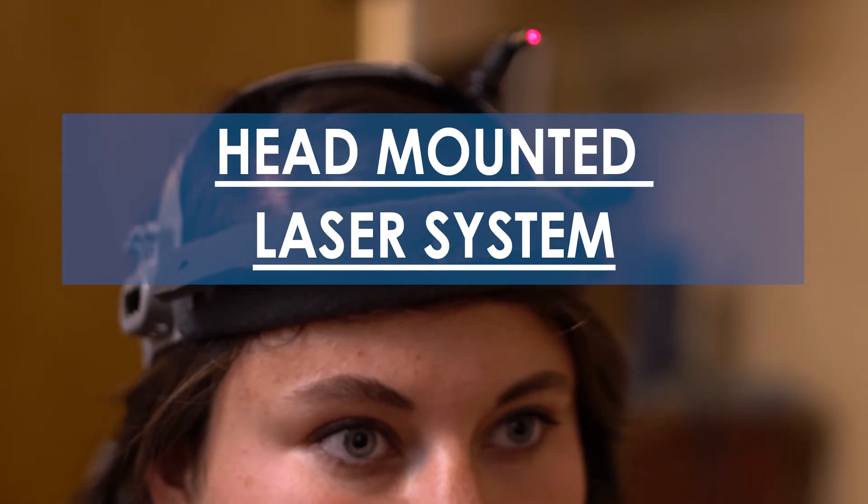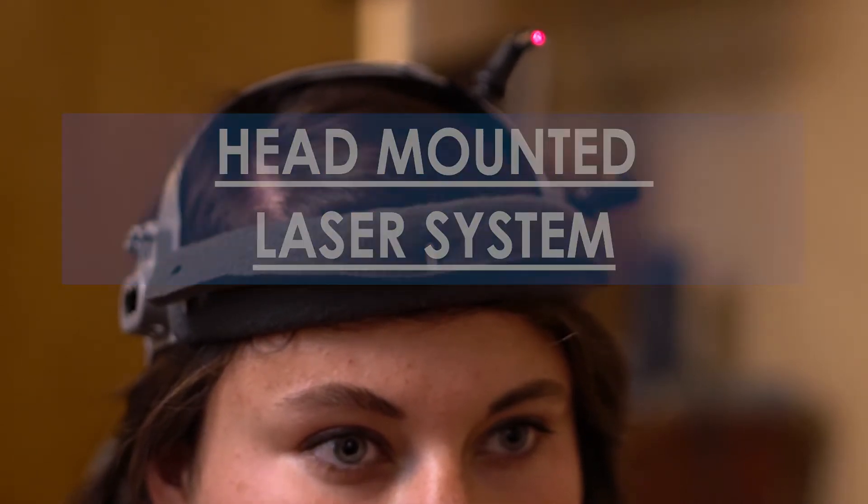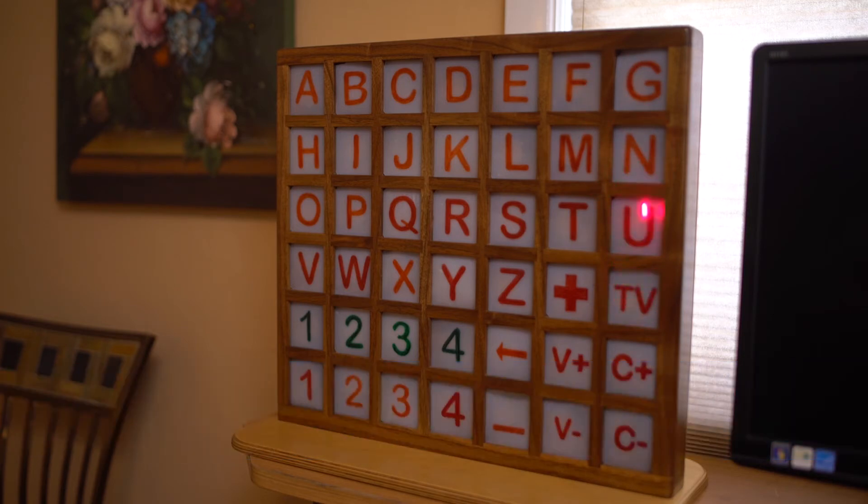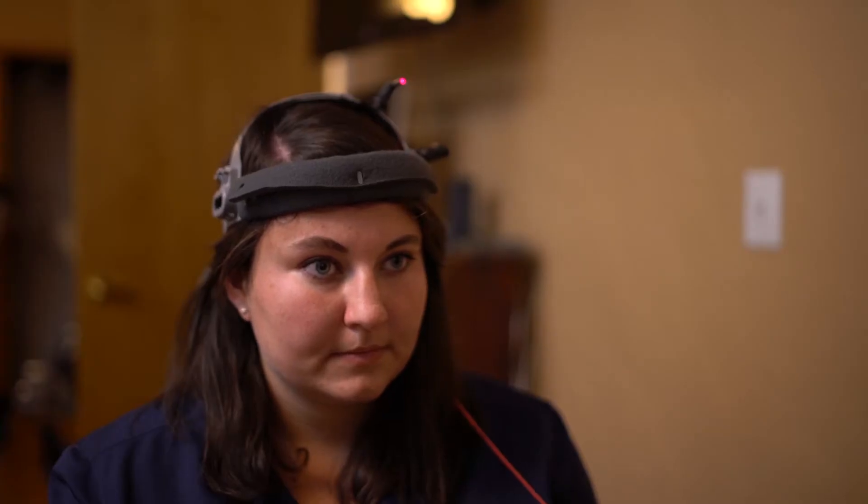This is a DIY head-mounted laser system that was developed to activate a communication panel from a few feet to several feet away. It was developed for a patient with ALS who could not use an eye tracking system or a sip and puff to communicate.